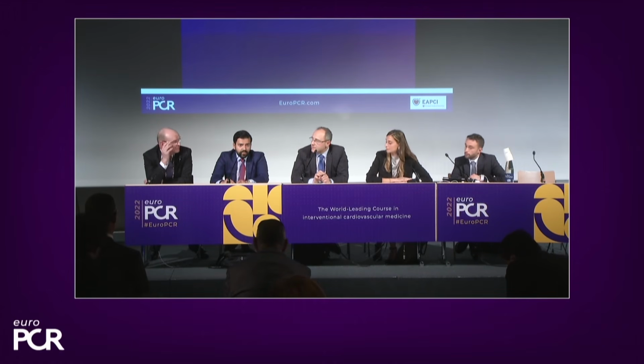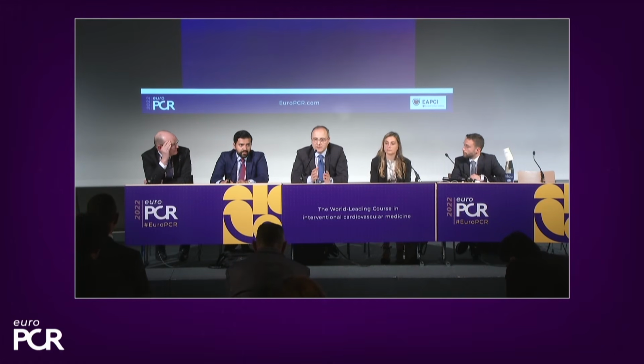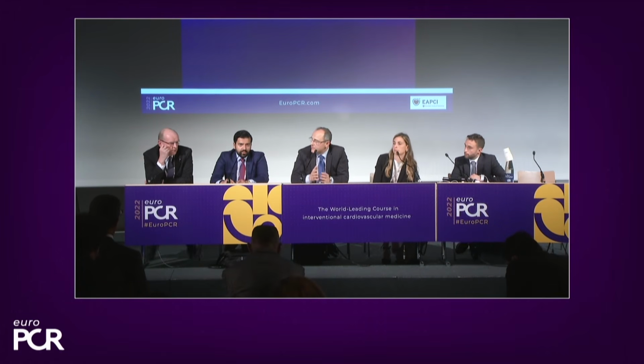It's a very important aspect because it doesn't just guide your stenting selection. You need to assess what the result is. The IVUS catheter is open. Of course, you open it up again. Any room for a higher pressure balloon here to optimize the stent, or is a non-compliant balloon enough? Well, you're guided by the IVUS.